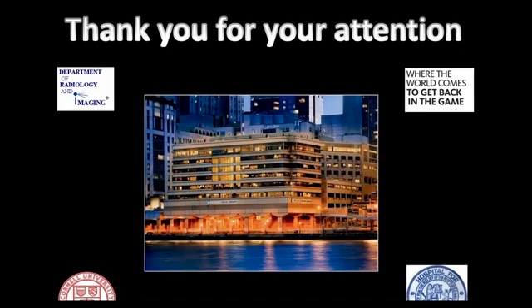Does it cause low back pain? I think it doesn't by itself. It's not a dominant etiology for low back pain. It's often part and parcel of somebody who has a listhesis or hyperlordosis. If you inject that area, do you get some symptomatic relief? Yes, you can, but again, the placebo effect from injections can be up to 30%. So I see Baastrups as not often a dominant, or not often a significant or relevant finding for pain. If I see it, I'll mention it, because again, it can be part and parcel of their pain syndrome.